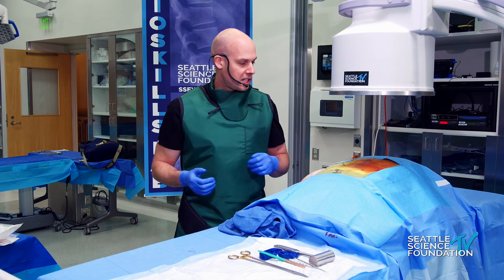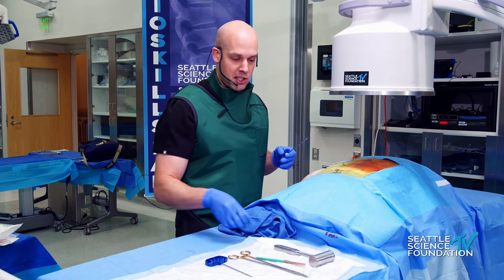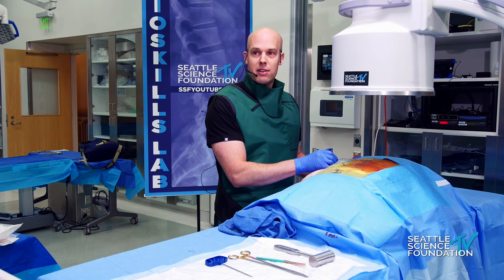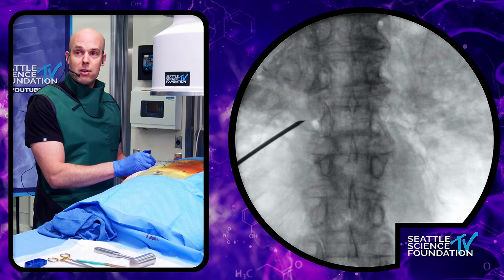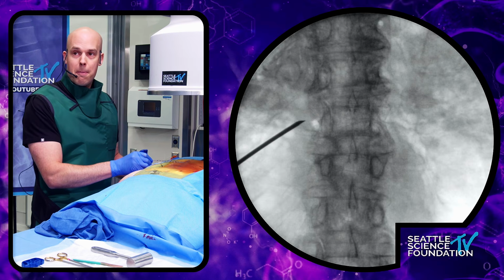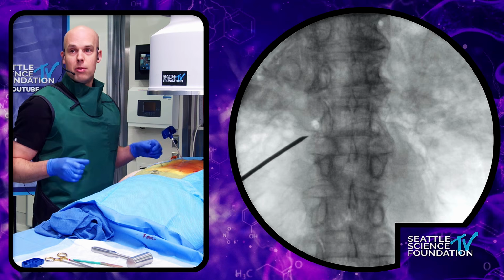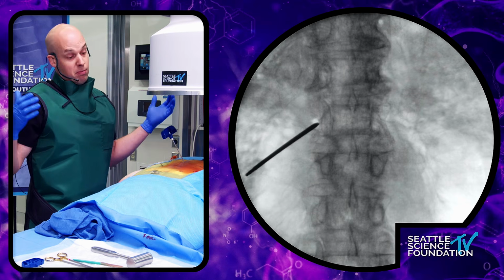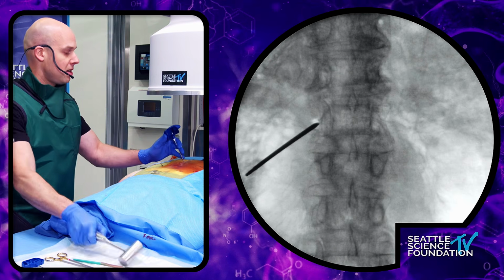So we'll start with a classic kyphoplasty approach. I'll start about 2 centimeters just lateral to the left pedicle here. And then we'll be able to go on bone. So again, these are procedures that can be done under local with moderate sedation. These are very fast procedures. We're talking less than 5 minutes, right?